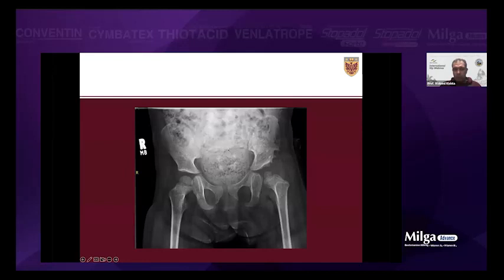Any other questions on DDH? So in summary, I do the surgery as soon as possible. If there's 6 months to 1 year, I do closed reduction with arthrogram. And for these kids, I take 1 shot of CT with the O-arm intraoperatively, with a very, very low dose, just to make sure that the Shenton line is reduced anteriorly in the axial cut.